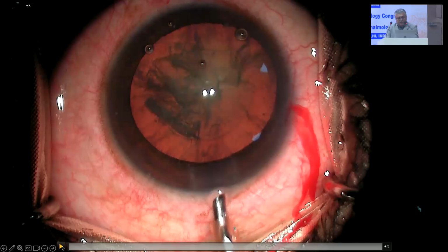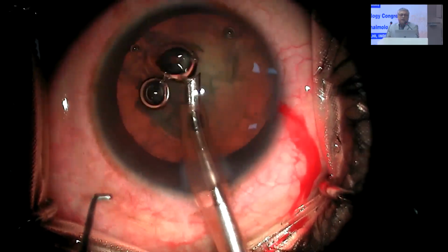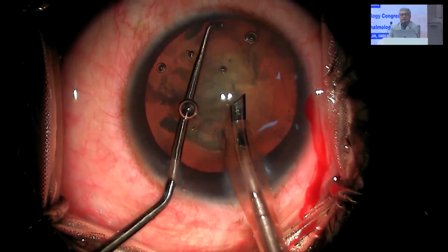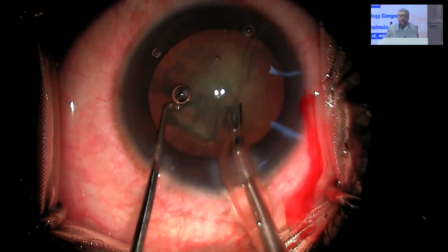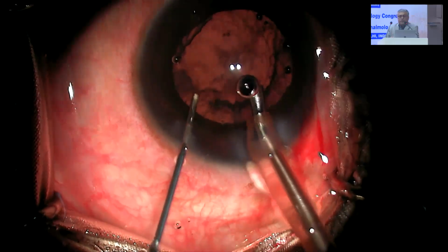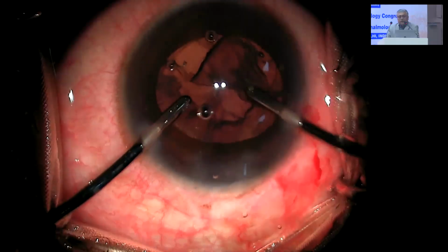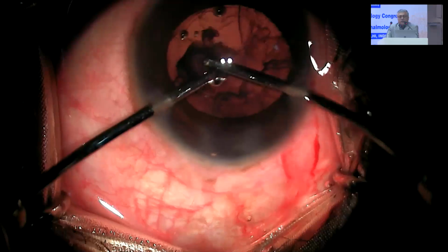In older generation machines, when we used to enter the anterior chamber, the whole lens iris diaphragm used to go back, deepening the anterior chamber, and the iris plane is hardly visible. So this is LIDRS. It can be overcome with a second blunt instrument. Just lift up the iris and the pressure between the anterior chamber and posterior chamber becomes equal, and the LIDRS breaks. While taking out the phaco probe, do not forget to inject viscoelastic in the anterior chamber. Otherwise, it might lead to severe catastrophic complications. It might lead to retinal traction and tear.